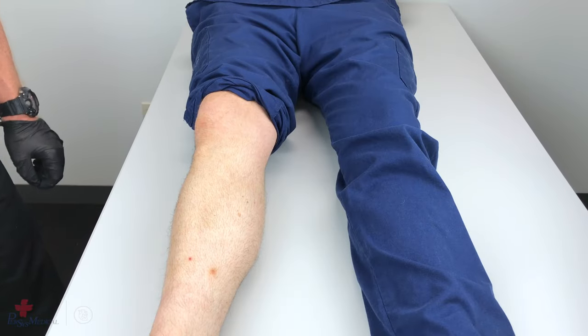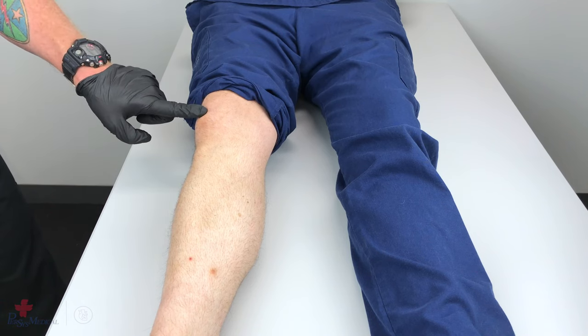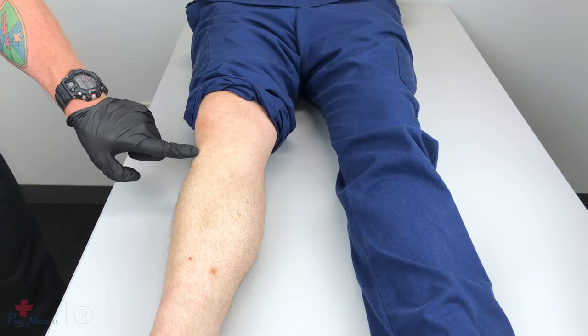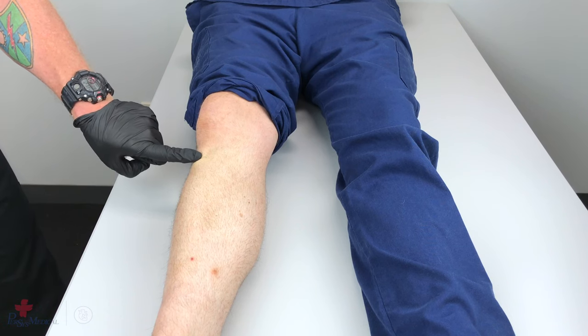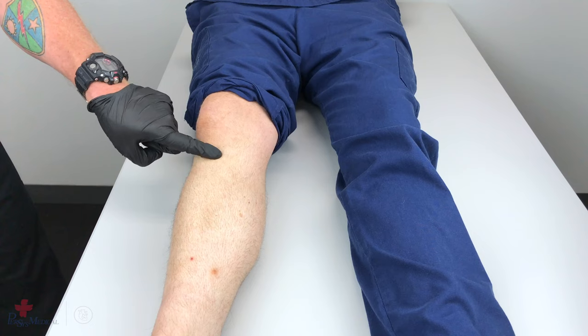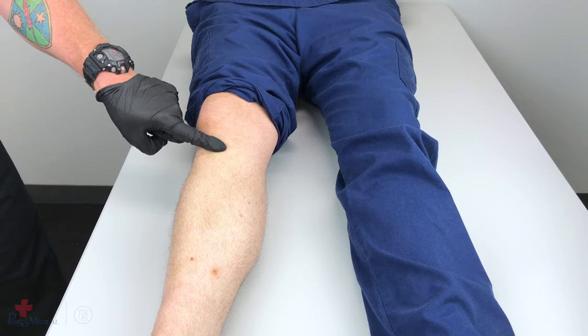To locate the proper tibial insertion site, on the anterior of the shin, below the kneecap, palpate the tibial tuberosity. Go approximately 2 centimeters medial to the tibial tuberosity, and approximately 1 centimeter superior. This is the proper insertion site for the tibia.